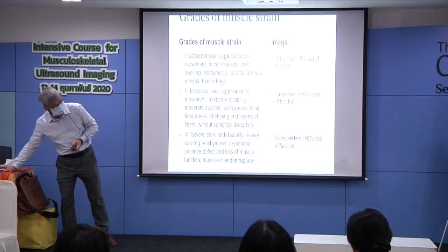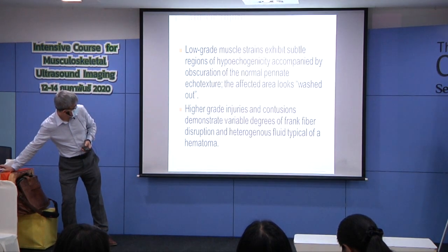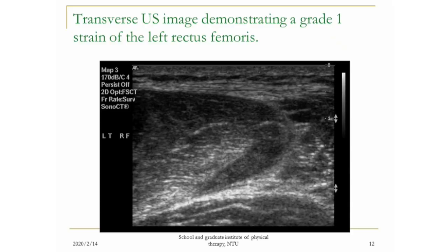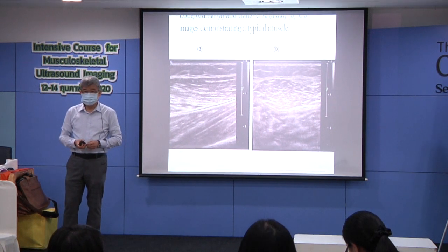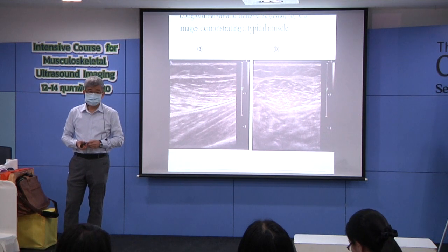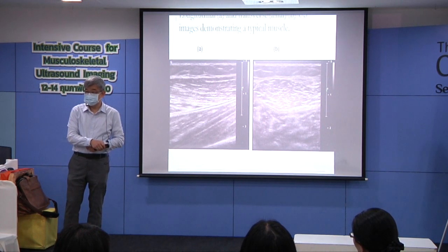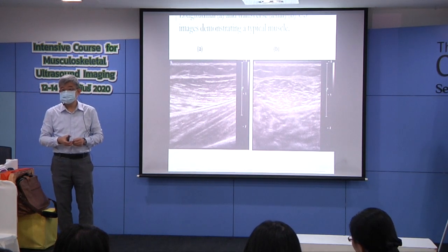Let's look at the following examples. Oh, sorry. This is an example of muscle injury in the rectus femoris muscle. The border is hypoechoic because usually the muscle looks like this, right? When you use your ultrasound to look at the neuromuscular bundle, you find the heads of the medial gastrocnemius and the lateral gastrocnemius are very, very clear, right? Like sunglasses, right? It's okay. If you didn't, we will practice later.